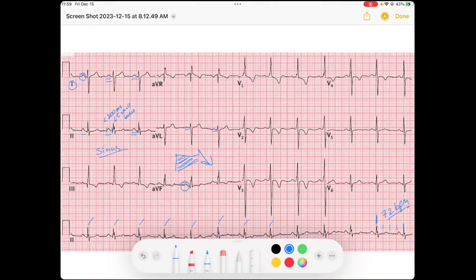Now let's take a look at our QRS. Our QRS is narrow, but the QRS axis is negative in lead one and positive in AVF. So my QRS is going down and to the right — going away from the lateral leads but towards the inferior leads. This is right axis deviation.